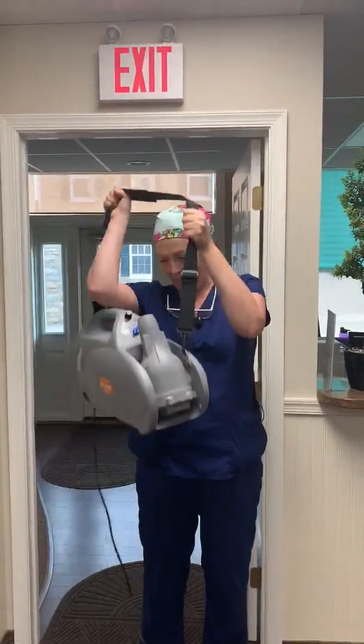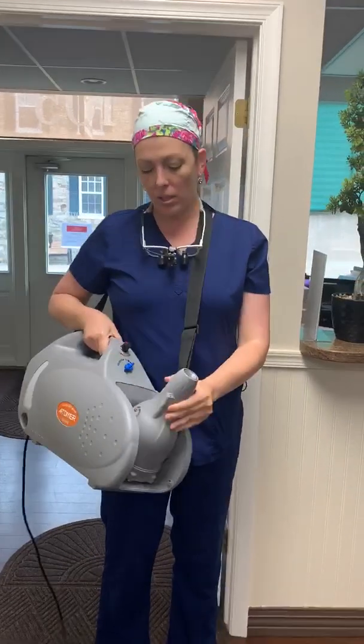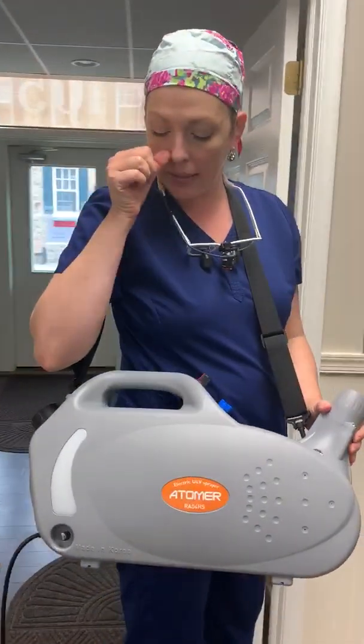Hi Mommy Dibs. I'm showing you how we use our fogger. So this is the machine. It loads in the back, it holds quite a bit of liquid, and it doesn't take much to fog the office.